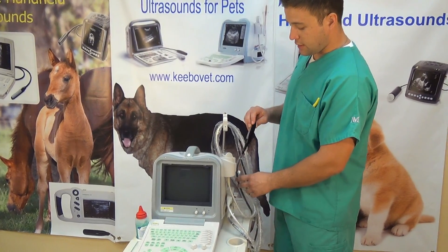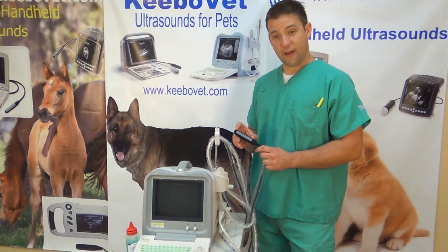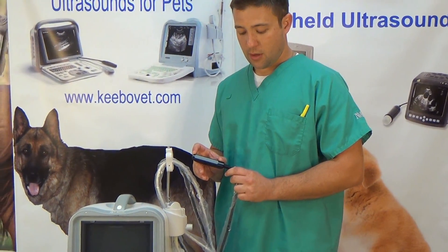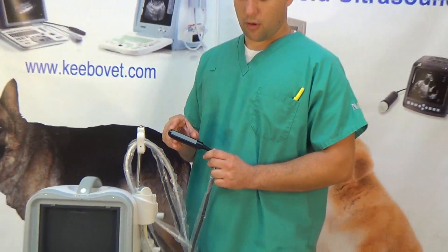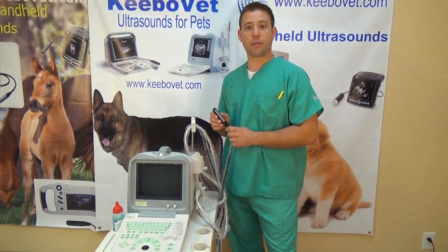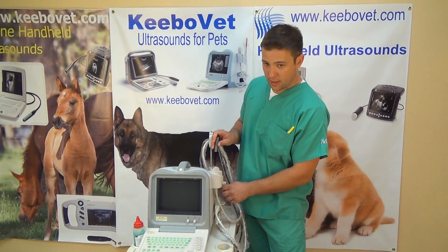This is a linear probe, also a rectal probe for animals. The face plate here you can see is pretty large — 70 millimeters, so 7 centimeters. A lot of the other machines are smaller, and the smaller the field of view, the smaller the image and the less clear. It's just better to have a bigger screen and more imaging, so that's another positive thing about this machine.